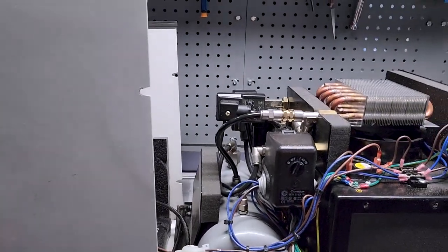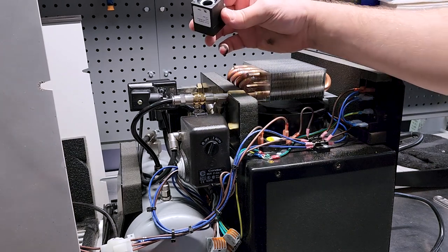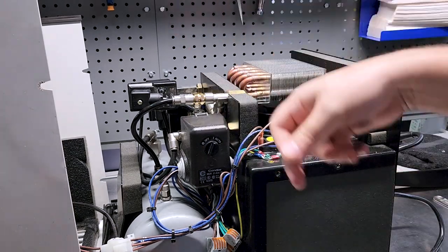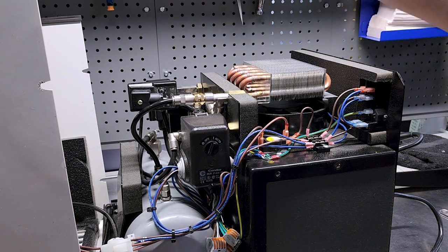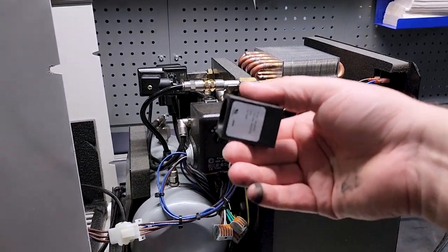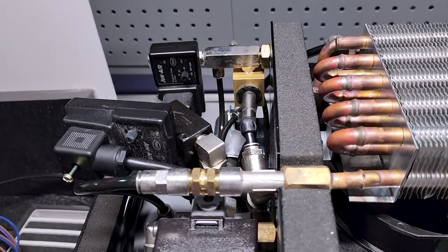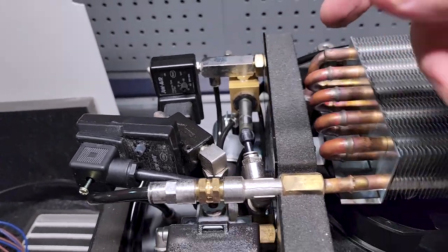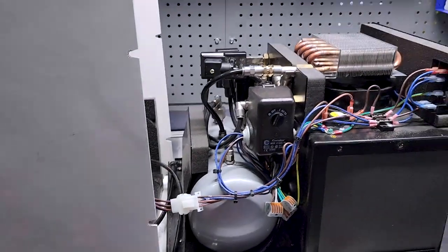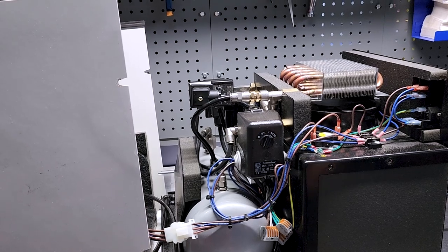So if you see a residue inside a solenoid like that, it shouldn't be there, because that is not a moving part. The moving parts are inside the dingle hopper down there. Anyway, it's really not that bad of a repair. The coil obviously has to be changed out, but also so does the solenoid moving components, which are down here inside this guy. So the whole thing is bought as a unit. It is electrically arcing mains to ground, which is technically very unsafe.